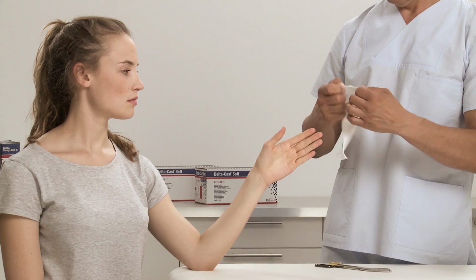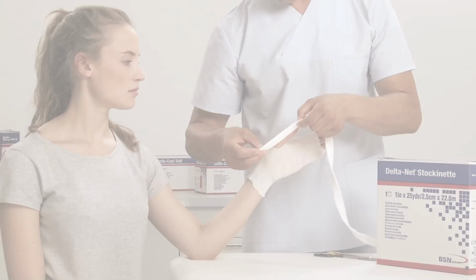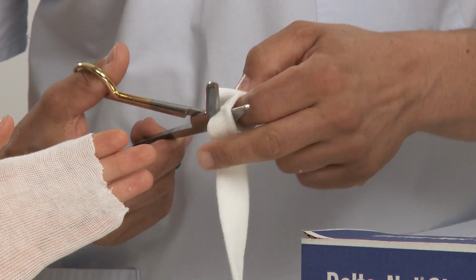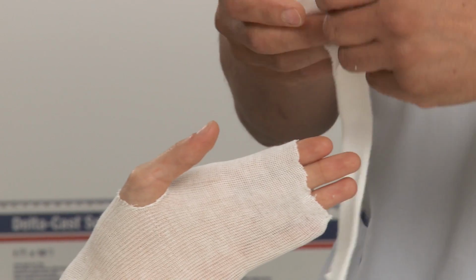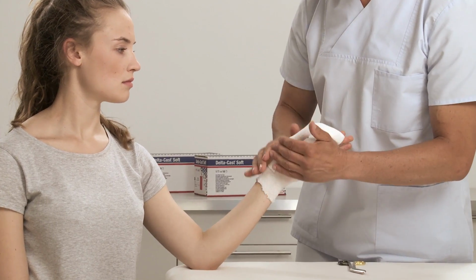Roll up stockinette before applying on limb to overcome sliding pressure during application. Roll off and remove all wrinkles and creases. Take a double thumb length of 2.5 centimeters or 1 inch width stockinette. Make a cut into the piece and slide this over the thumb. If the patient has prominent bony areas, extra padding may be required.